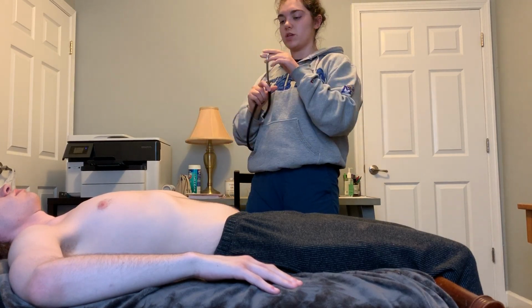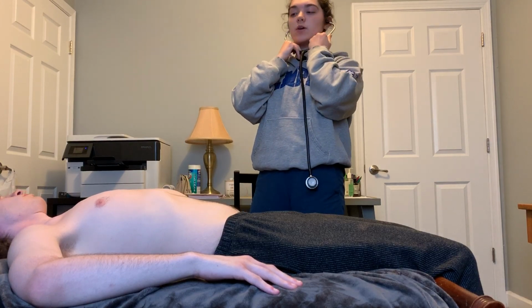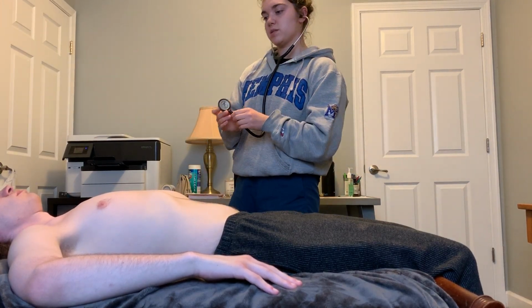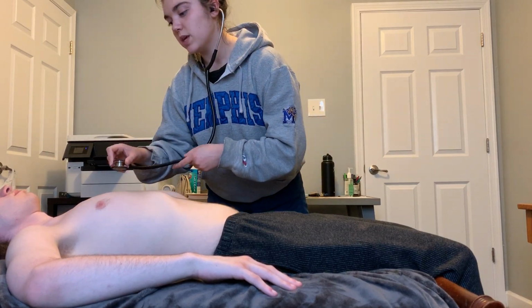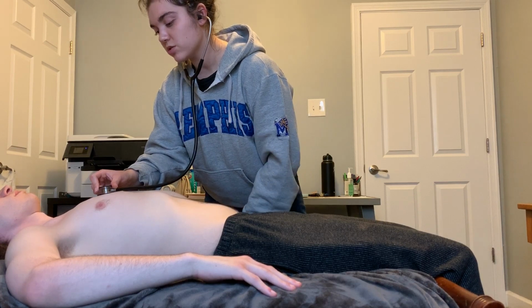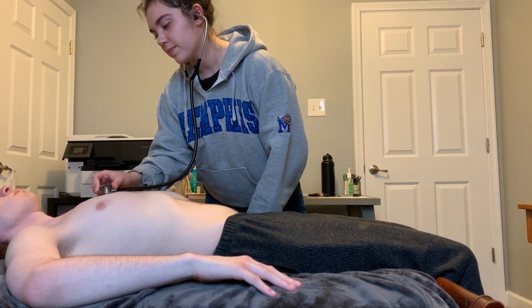So next I'm just going to auscultate the 4 valves of your heart, starting with the aortic, and I'm going to do it both with my diaphragm and with the bell of my stethoscope. First I'm going to start with the aortic valve, which is in the second intercostal space, right sternal border.